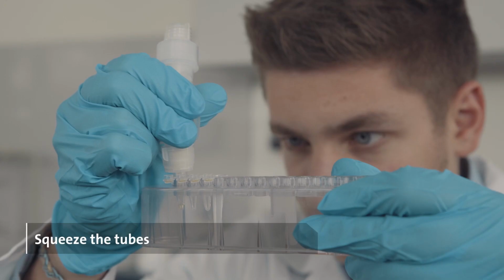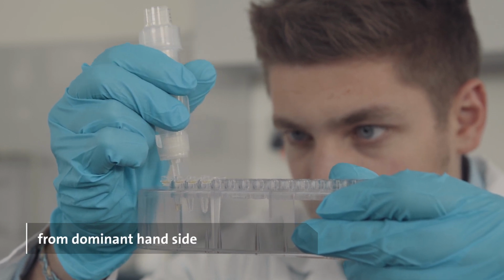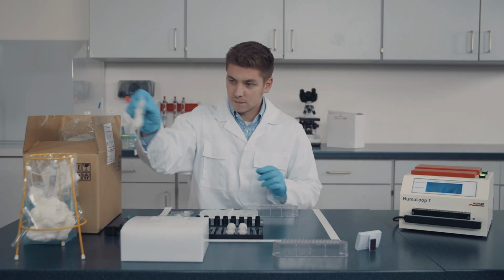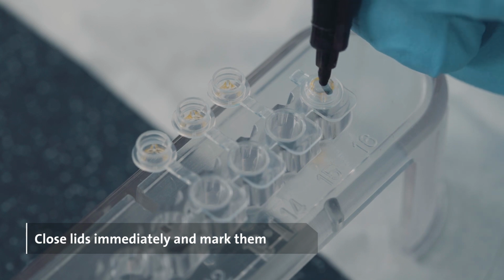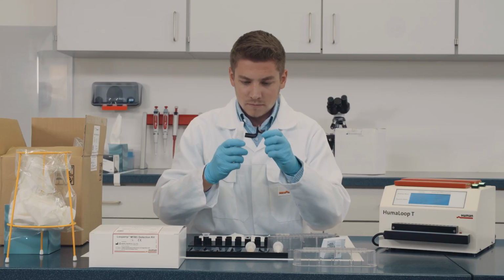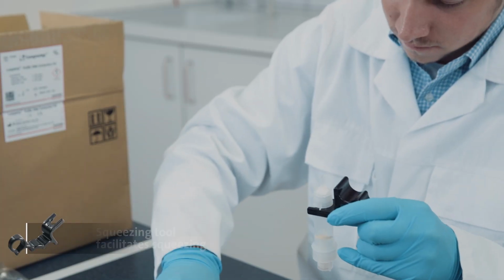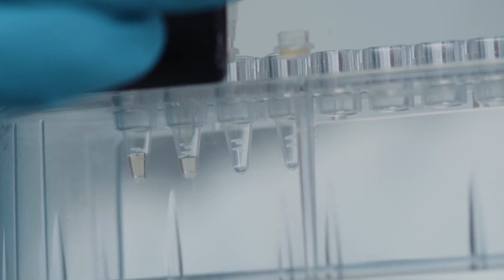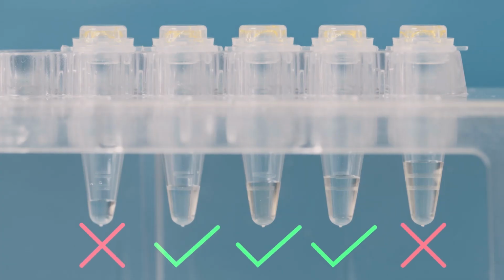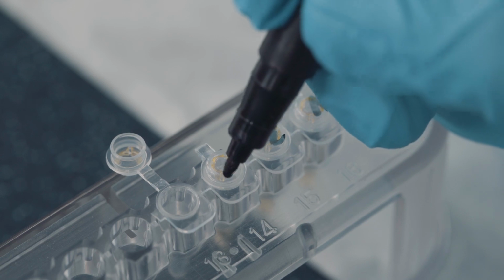Squeeze the tubes and inject the extracted DNA directly into the reaction tubes and discard the used adsorbent tubes. Close the lids immediately and mark them accordingly. This step could also be done with the help of the squeezing tool. Make sure that the amount of DNA solution is in the accepted range. Repeat this step with all adsorbent tubes.